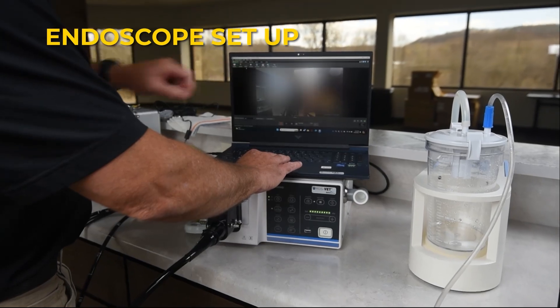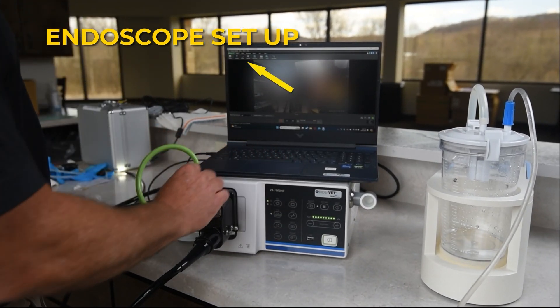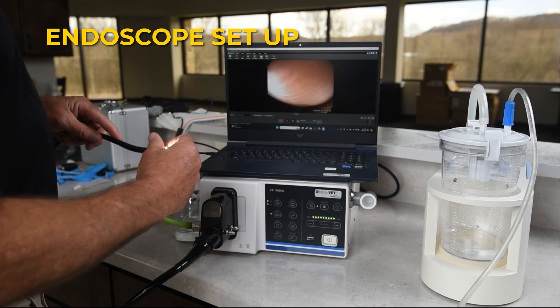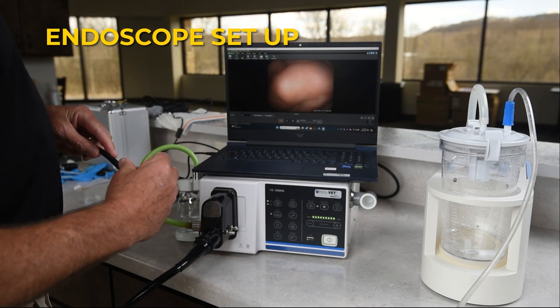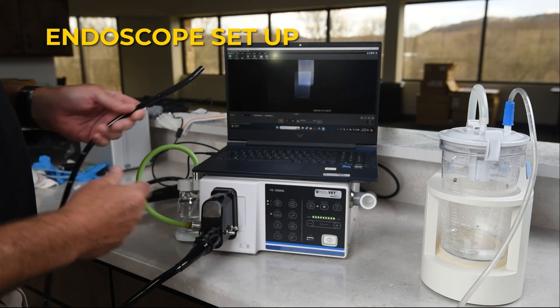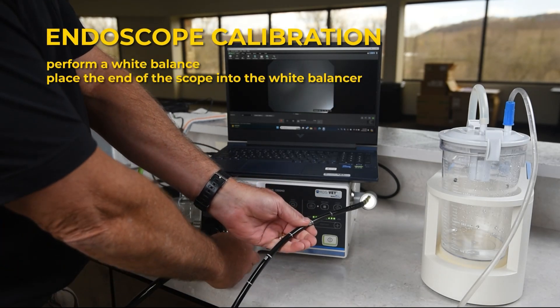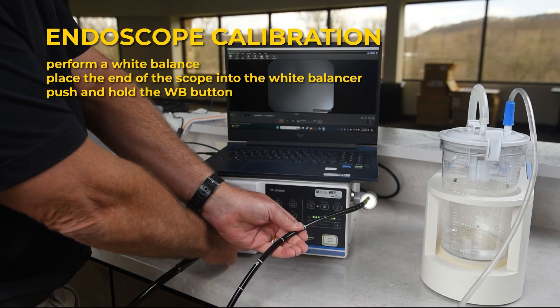If the scope image doesn't appear, switch to the Capture Device tab. The laptop sees the processor as the capture device, showing up on the screen of the computer as the scope image. Perform a white balance by placing the end of the scope into the white balancer and holding the WB button.